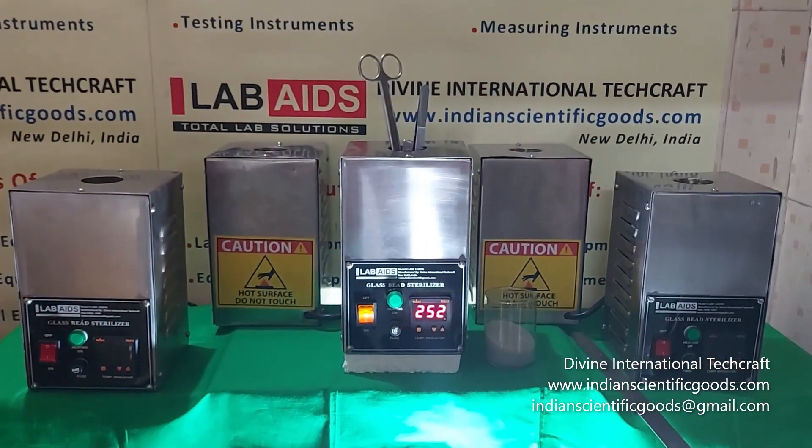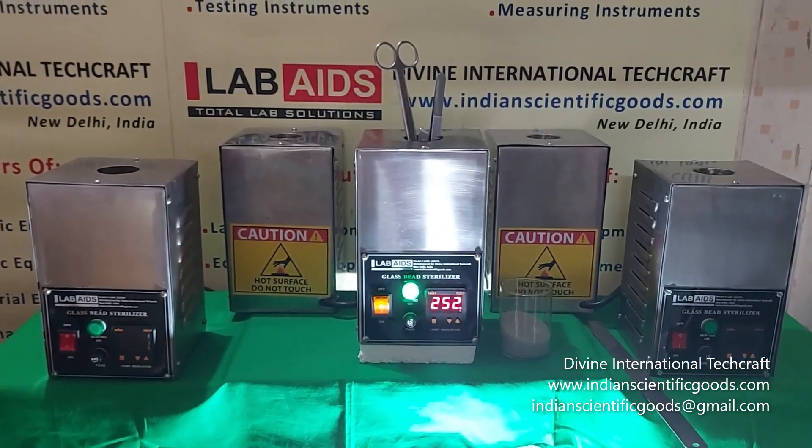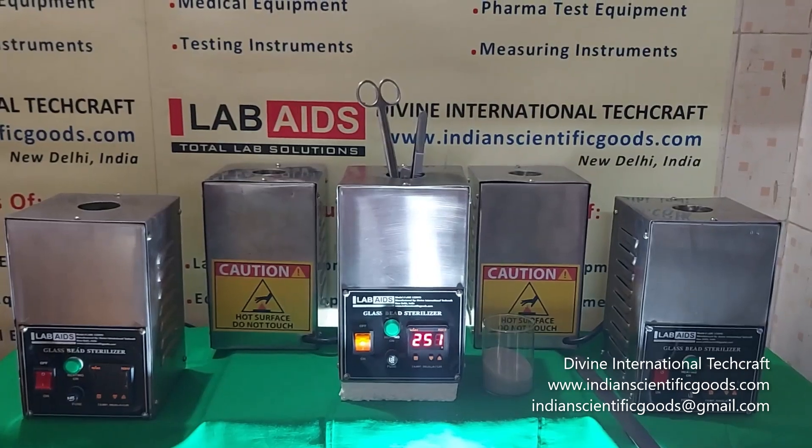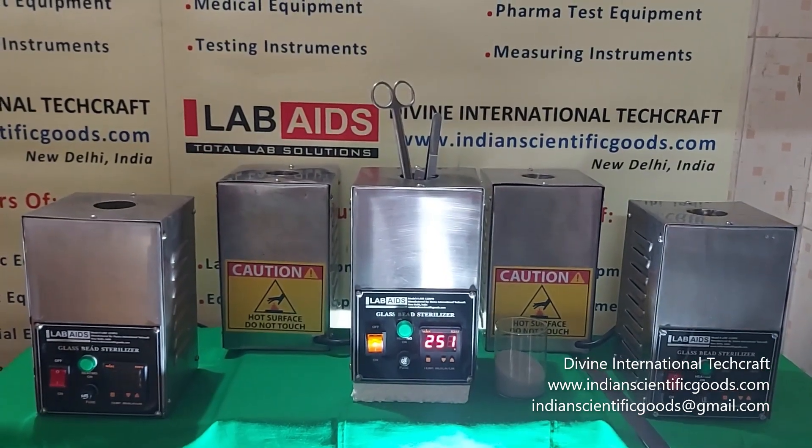With a compact design, these can be easily placed in fume hoods. We wait for your inquiries and orders for these products. Thank you.